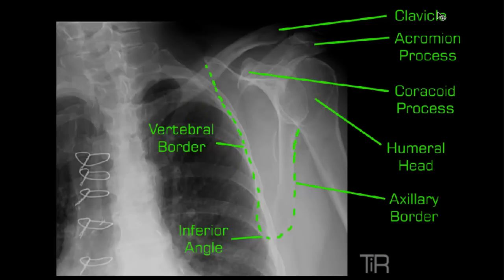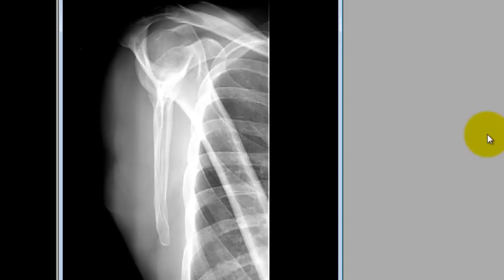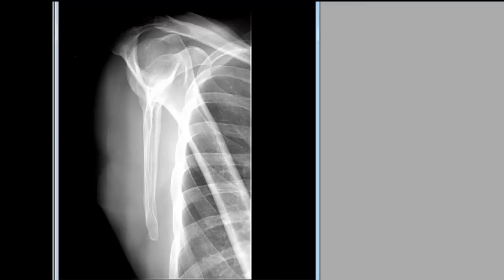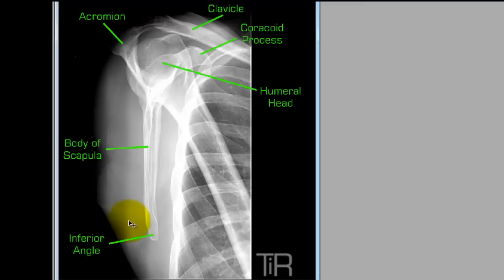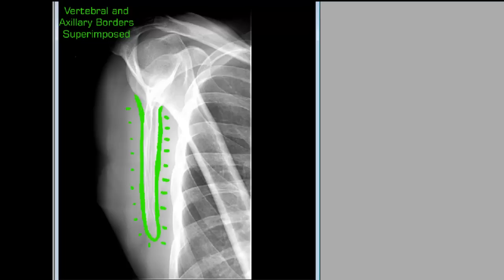Let's look at our first image — let's call this an LPO. I'm not sure if it was upright or supine, but it's beautifully positioned. You can see separation of the scapular body from the ribs. You see a humeral head right between the acromion process and the coracoid process. The inferior angle needs to be included as well. Notice that the vertebral border and axillary border are superimposed, and that is ideal — that's what we're shooting for with this position.